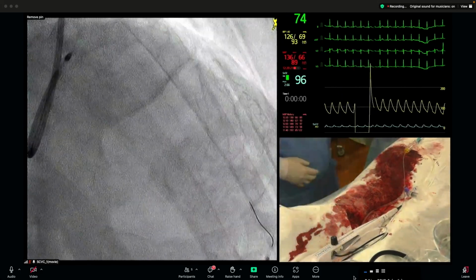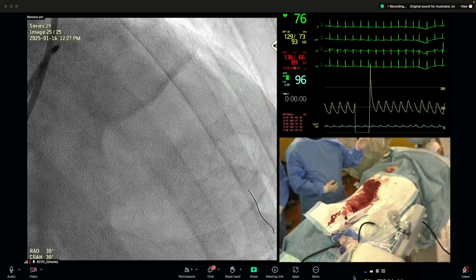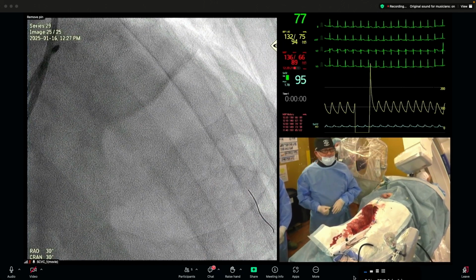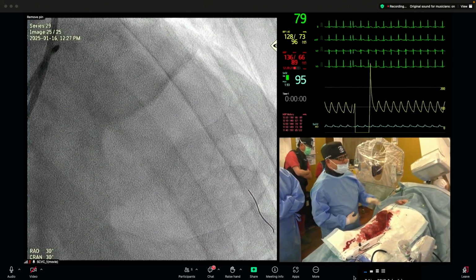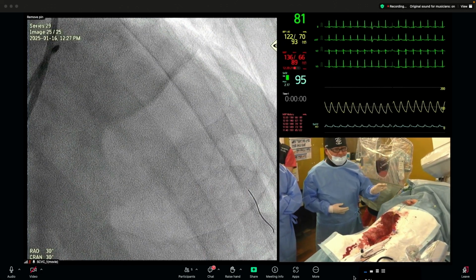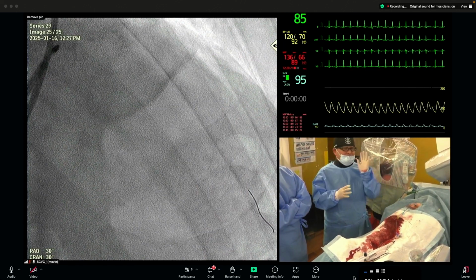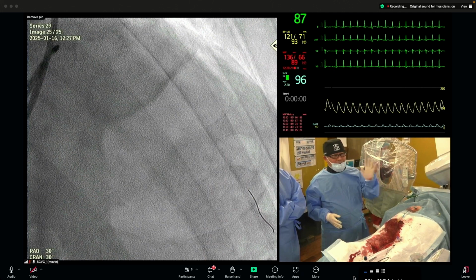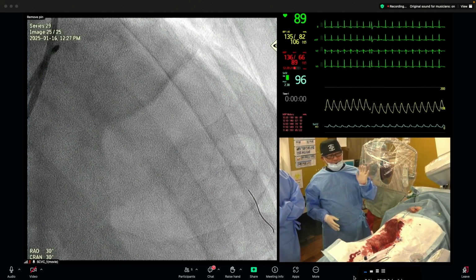Yes, very nice. Question: we have two volume reduction devices, of course the OAS and the rotablator. I sometimes show this in my presentation. Based on the physics, the rotablator has 4 to 5 times the ablation performance of the OAS.